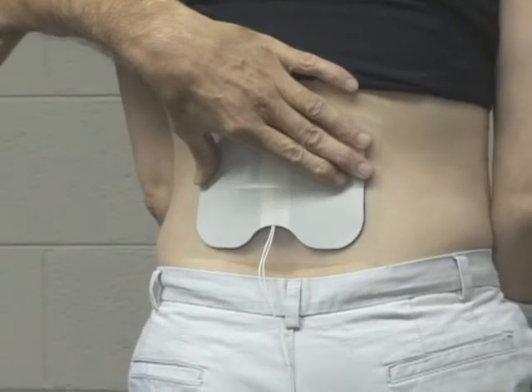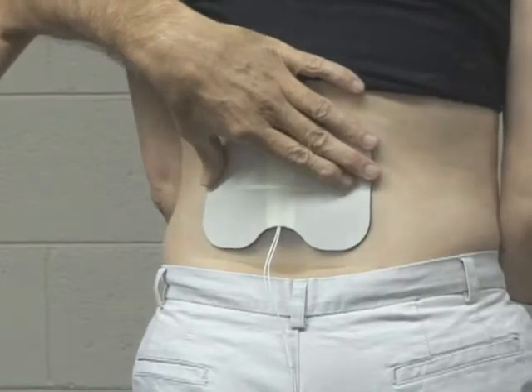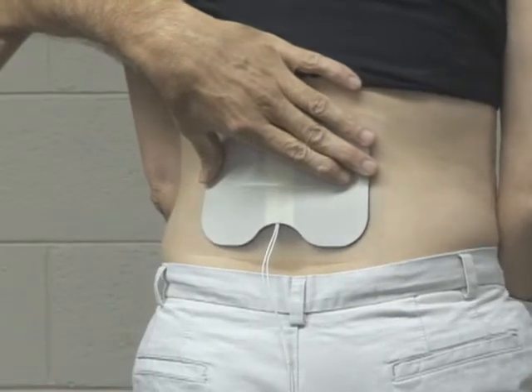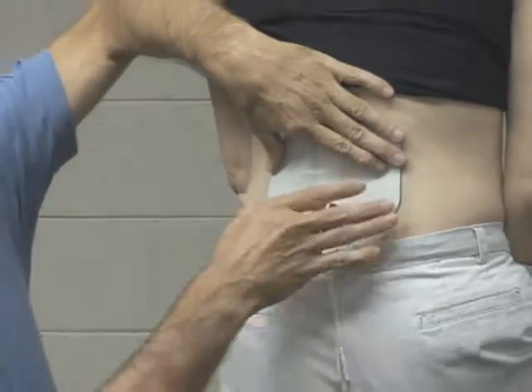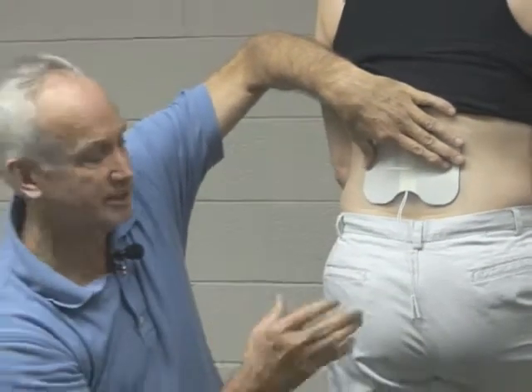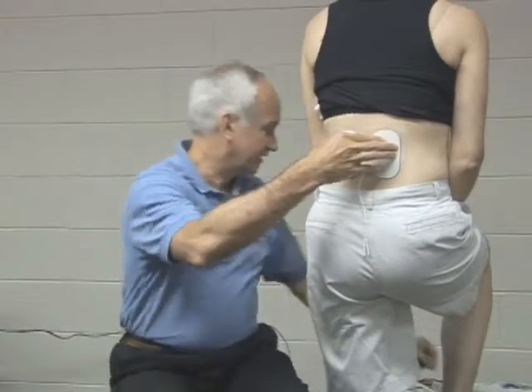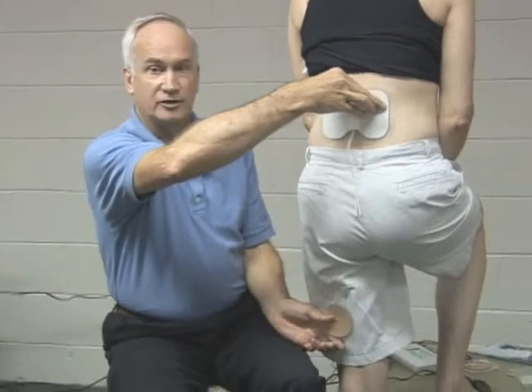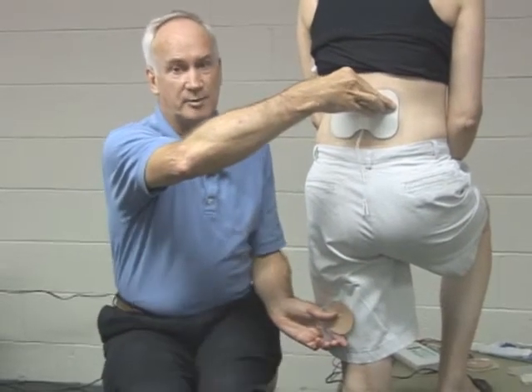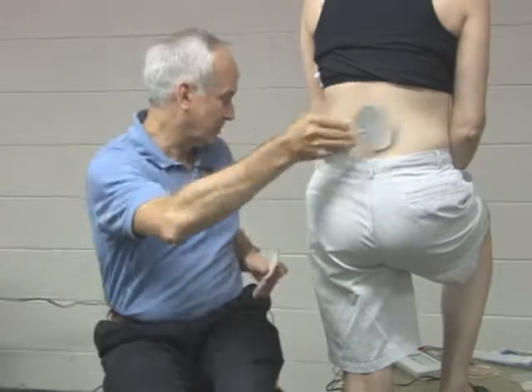It is not uncommon for a patient starting off with back pain to eventually develop sciatic pain. This generally happens because the patient guards against the pain and changes their posturing, creating additional stress that develops into secondary pain. When that happens, we may use an electrode like this and put another electrode further down to combat the secondary radiating sciatica pain, then work toward addressing the primary source.